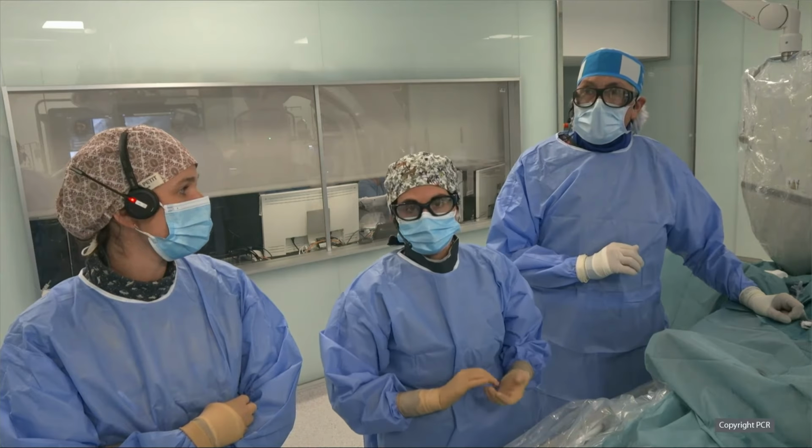The rationale for choosing here orbital atherectomy as the technique of choice is that with rotational atherectomy, you may expect a lot of burr bias that will be directed towards the proximal part. Here you can see it now, I think.